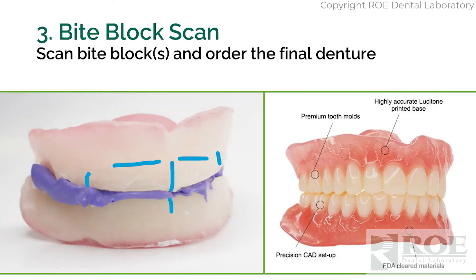Which brings us to number three: bite block. Let's say you completed step two and we send you a bite block. At this point, follow traditional methods — high smile line, mid line, cuspid lines. Use an actual knife to cut these in grooves so they can be clearly seen when scanned in the software, as opposed to using a marker. Mold the wax as normal for lip support and carve the wax, if possible, for a plane of occlusion. Spend some time on this part of the process so that we can go right to a final denture. 95-plus percent of bite blocks that are scanned go right to final dentures — we skip the setup. That's another wonderful thing about digital.